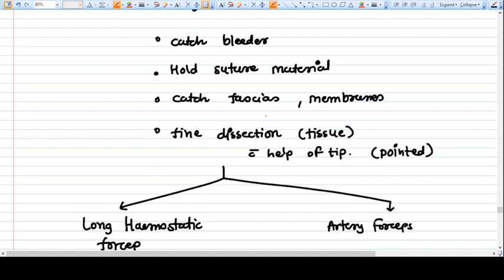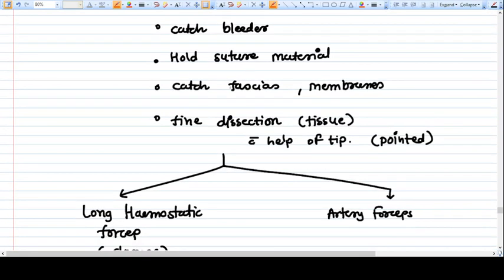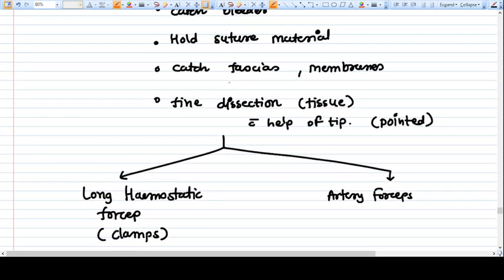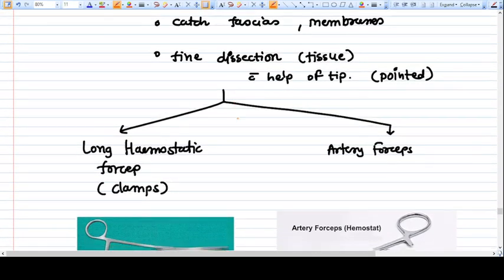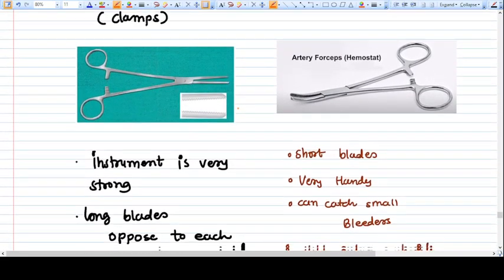If you try to catch an abdominal wall with artery forceps, you can't hold it very strongly - it will slip. And if you try to give more pressure, then it will rupture the structure. So you can't use artery forceps to hold structures like abdominal wall or fascias perfectly, though you can hold it, but not as perfectly as we want.